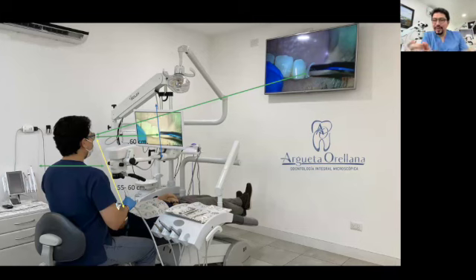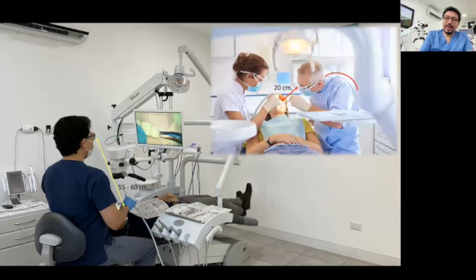But there is a small difference that can represent a problem if you are working removing a broken file, for example. We don't need to work in this way. Look at this doctor, 20 centimeters away from the mouth of the patient. During the pandemic, we understood how important it is to have a proper, safe distance, a biological safe distance, between the mouth of the patient and our head.